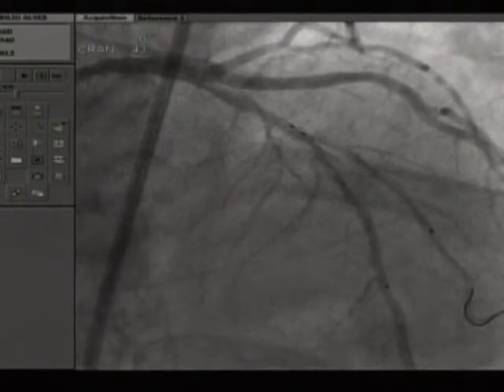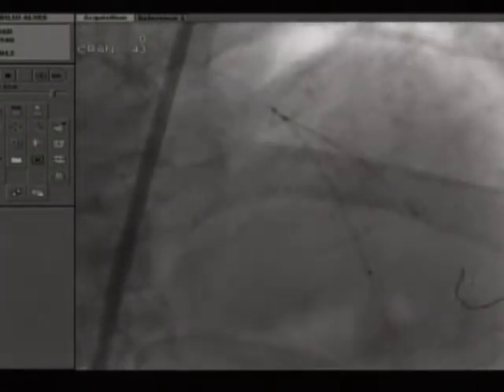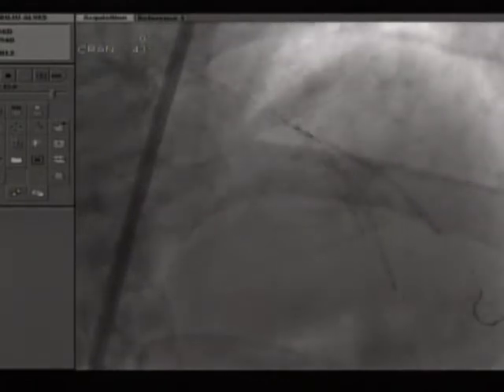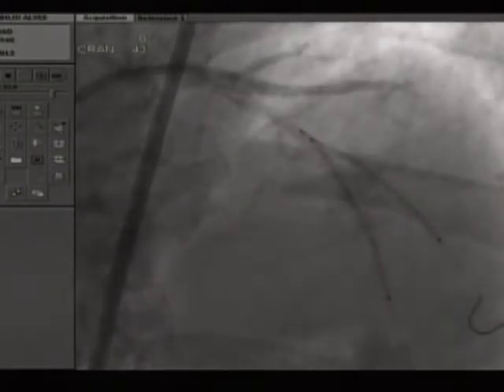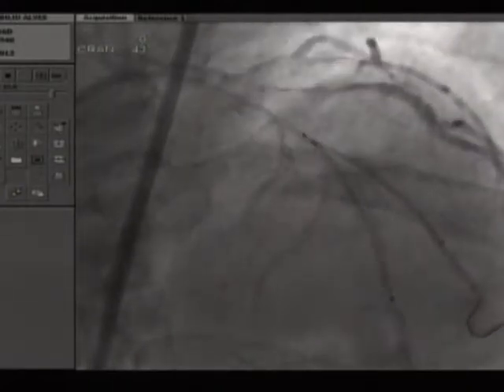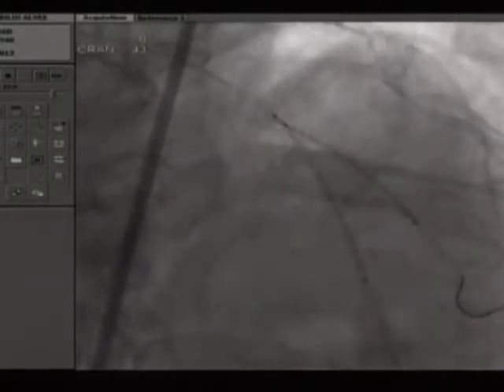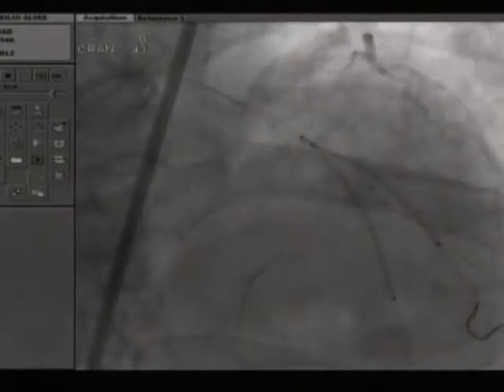I think the difficulty with trying to do the mini crush this way is you can miss the ostium of the branch with your stent, and that's where knowing where that is by IVUS or other means matters, looking at the proximal marker on that diagonal, you wonder how close it is. Yeah, and Expedito, what you said, you don't have it here, but for us in Europe, it would be a perfect case for a dedicated stent. Perfect case. Long lesions, bifurcation, that would be really fabulous.